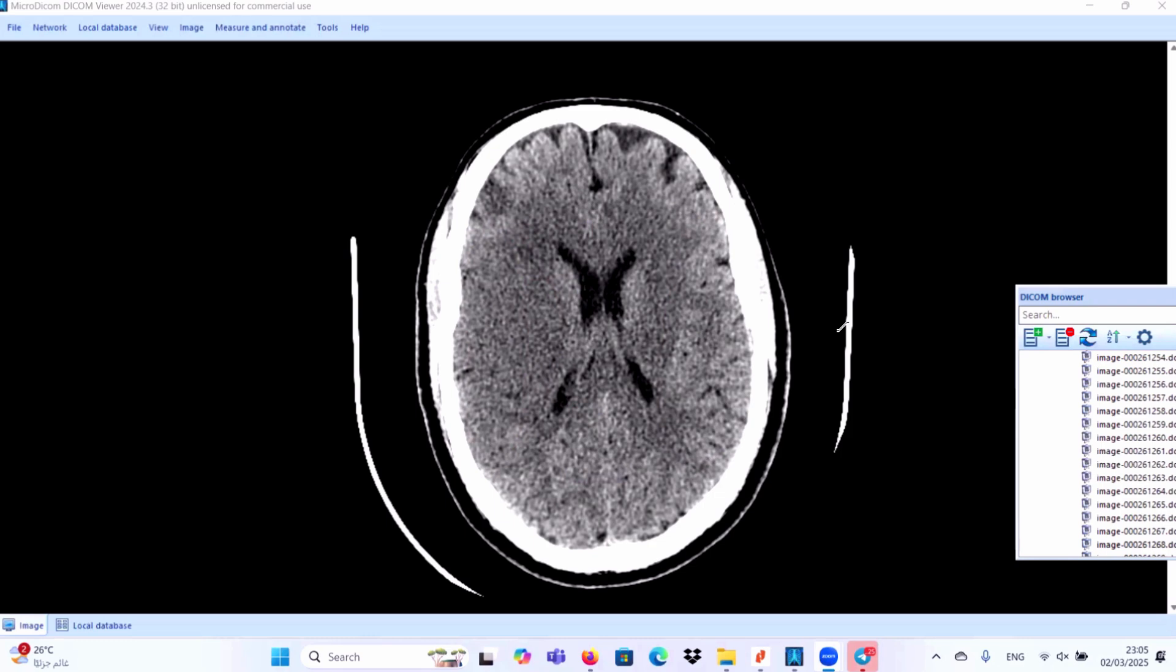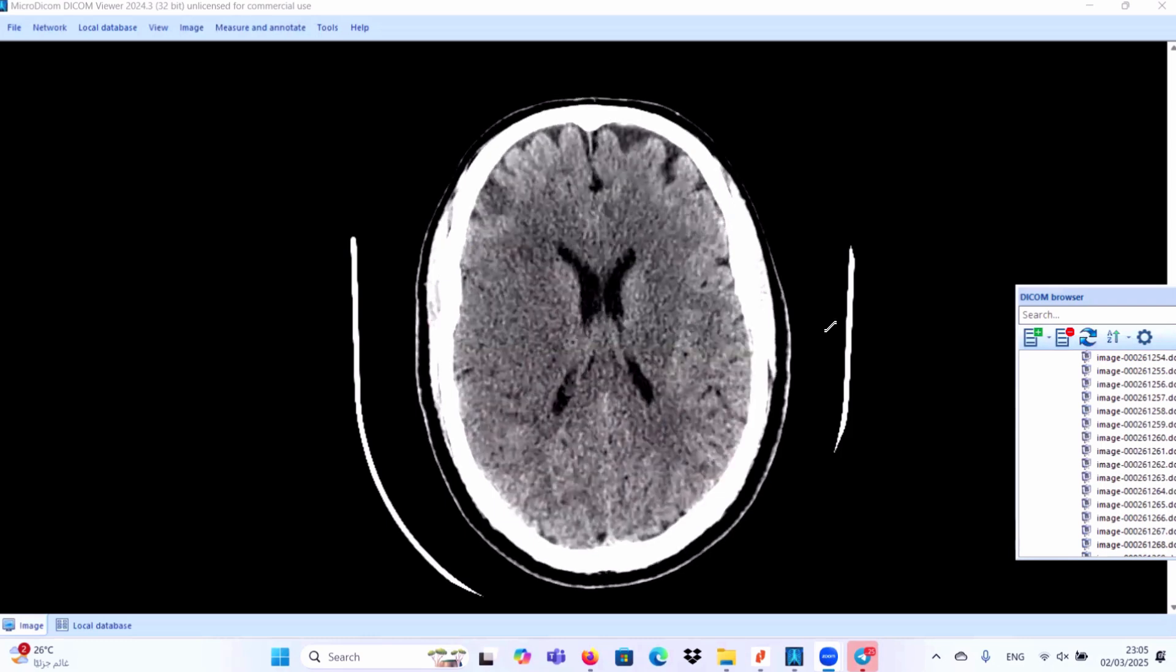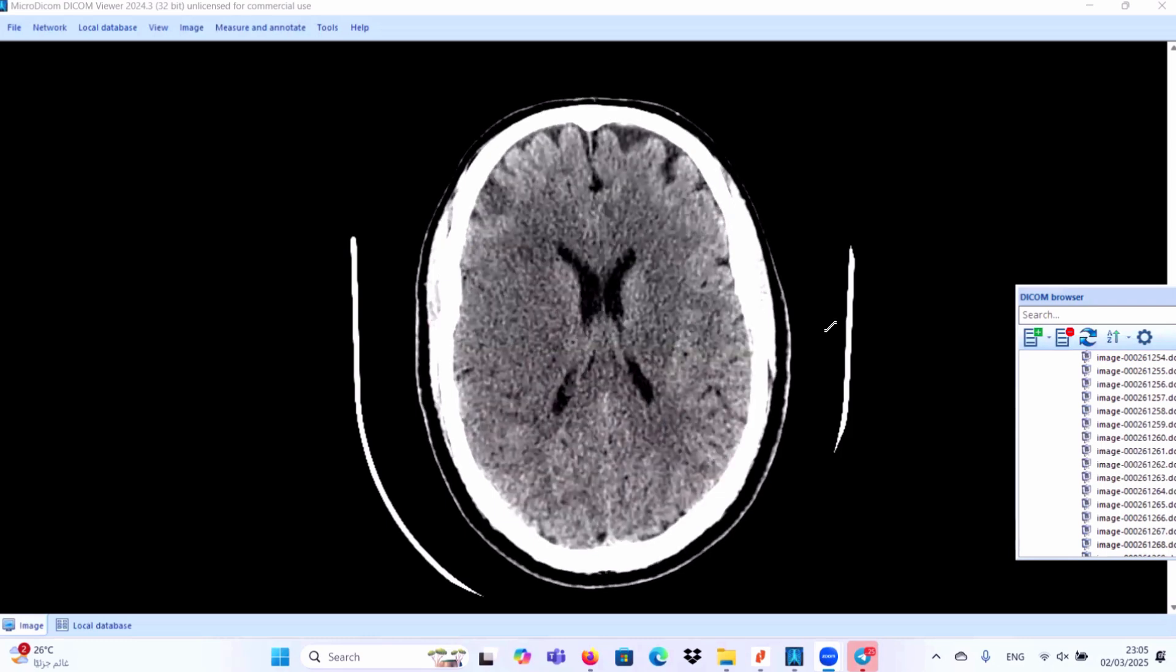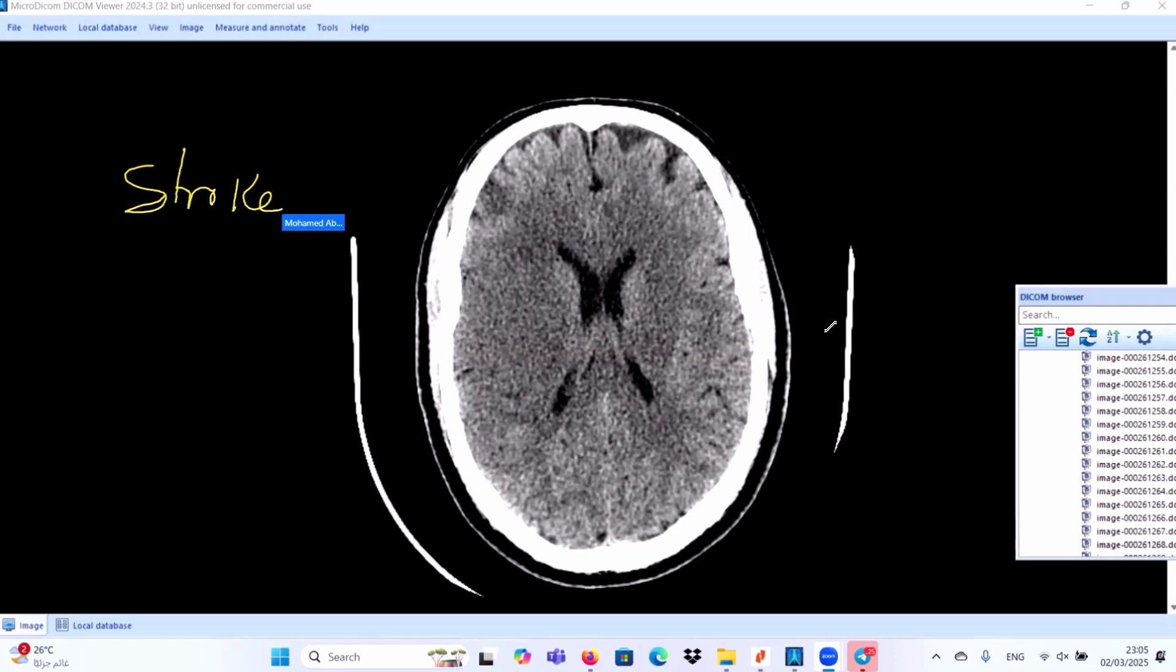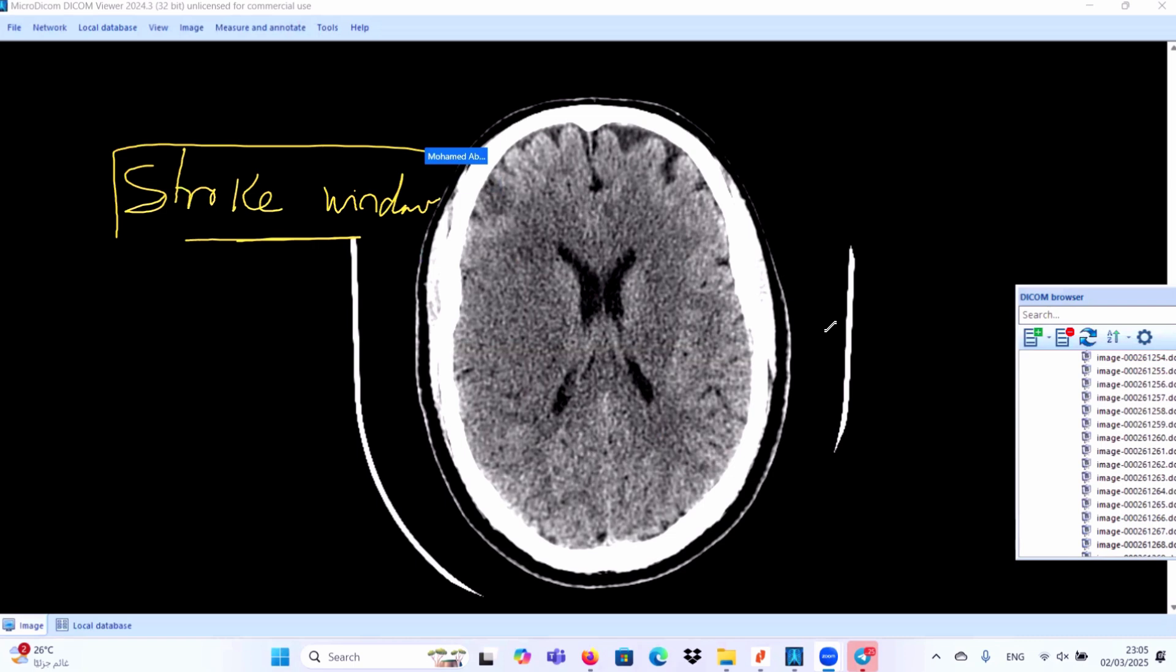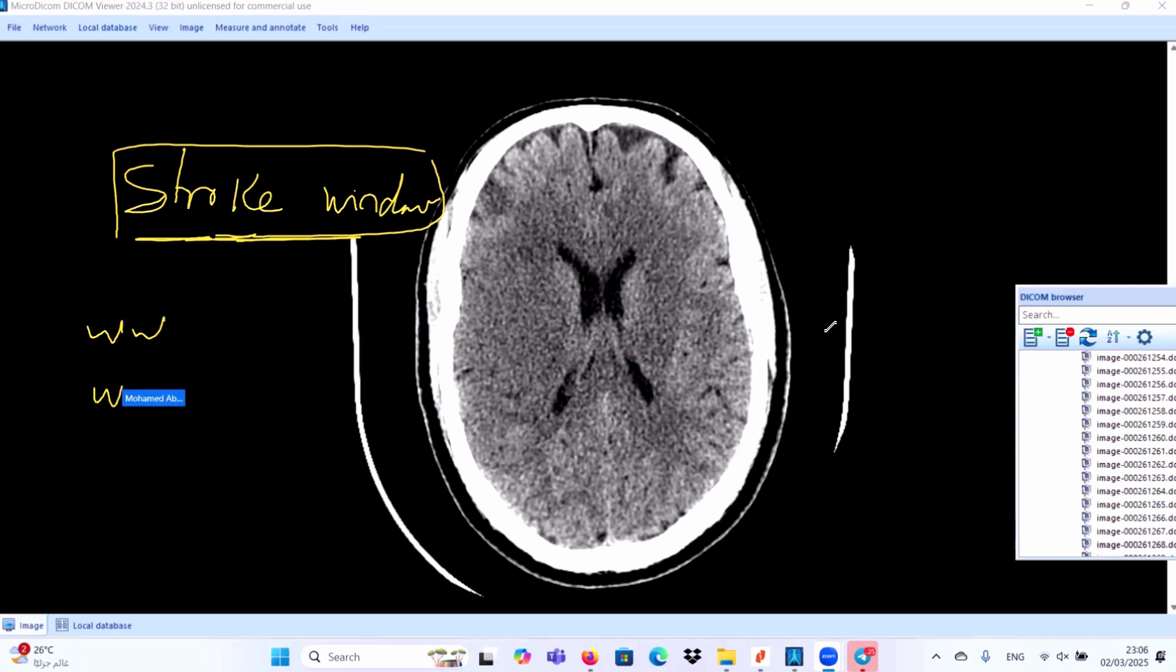In these cases, if you are still in doubt or you are suspecting cerebral infarction, you can use stroke window. Stroke window is very important. Don't forget this window. Any case suspecting stroke, use window width and window level 40/40.